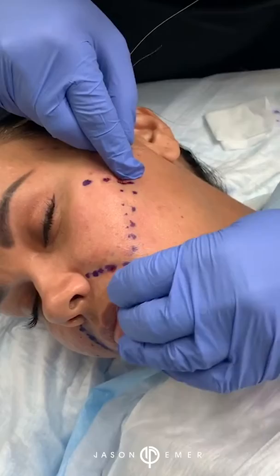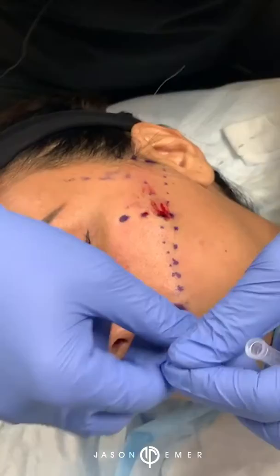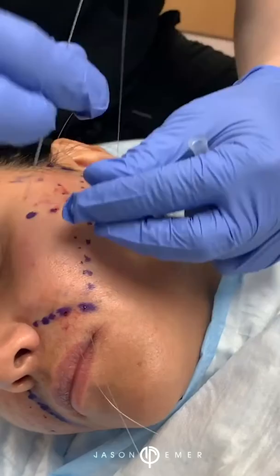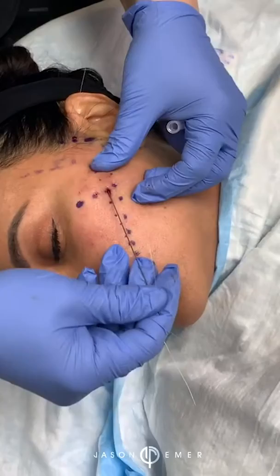Remember, as I've been talking about in the past, we used to just fill those lines, and then the problem was that people look puffy — they look overdone. What we've learned over the past few years is that it's not always about volume; sometimes you really need to lift the skin. So what we're doing here is placing these threads to give her underlying support to help lift that area and over time build collagen.